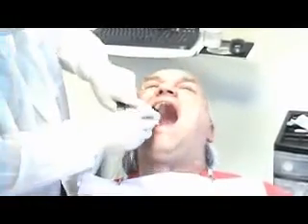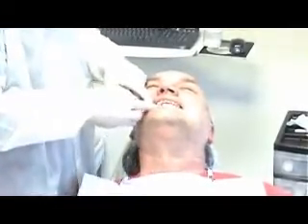You're done, sir. There you go. I'm going to give you some gauze. Open big. Could it have gone any better? Was I the best so far today? You were probably the easiest. Everything went very, very smooth with you. You looked through the picture, you applied the right pressure, you pulled it out cleanly, and that Novocaine thing — you got that down pretty good.